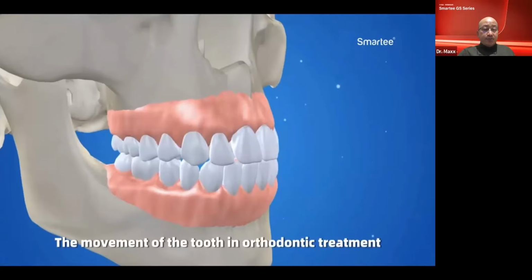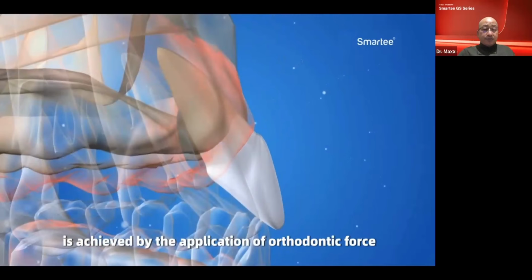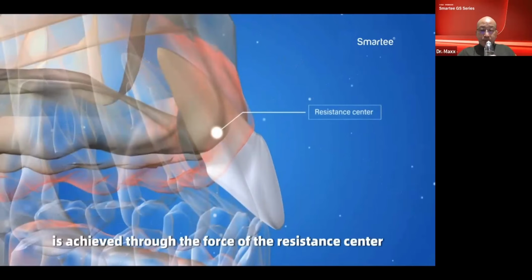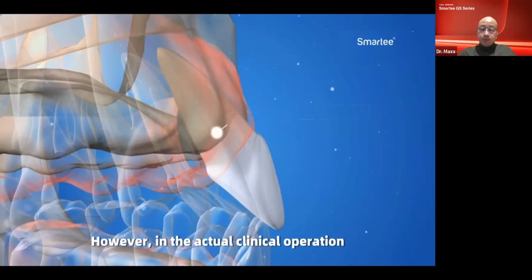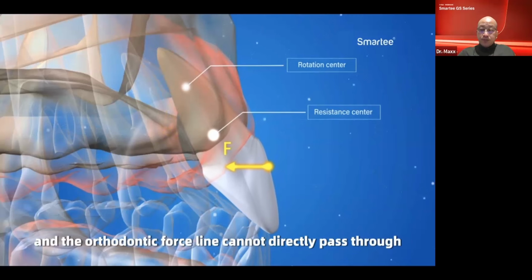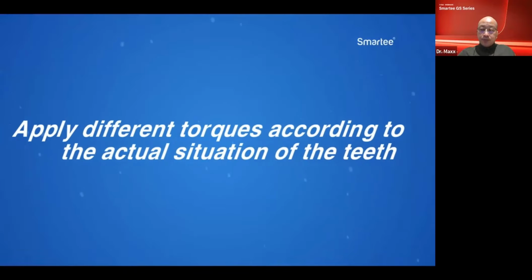It's quite important. The movement of the tooth in orthodontic treatment is achieved by the application of orthodontic force. The ideal orthodontic force is achieved through the force of the resistance center. When the force line of the orthodontic force passes through the resistance center, the tooth performs a translational movement. However, in the actual clinical operation, the orthodontic force acts on the crown, and the orthodontic force line cannot directly pass through the resistance center to rotate teeth.